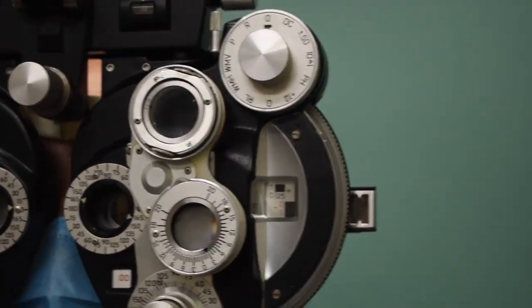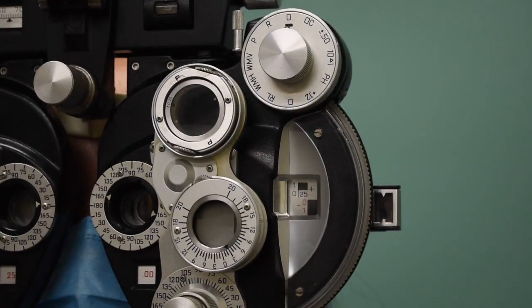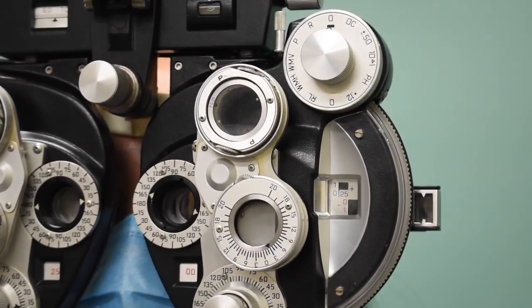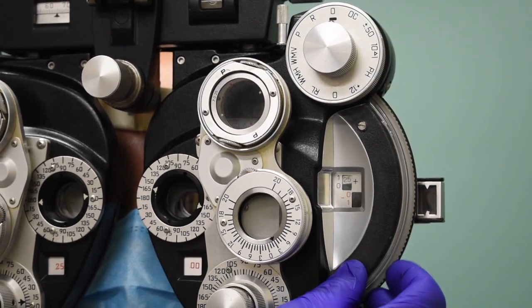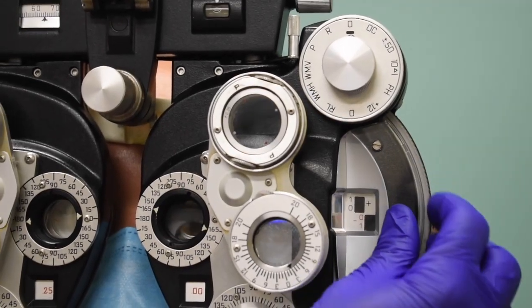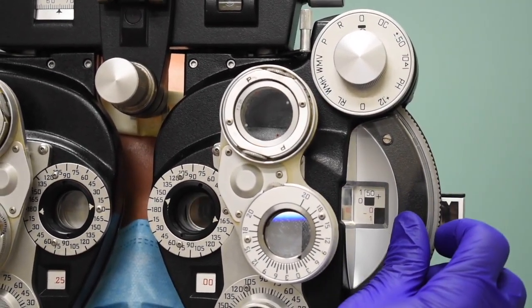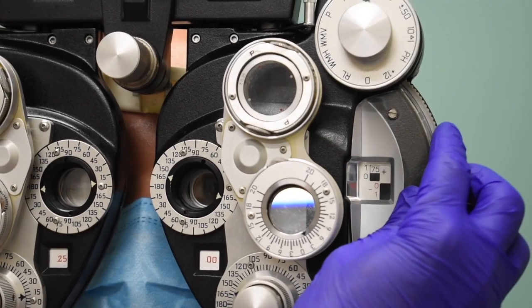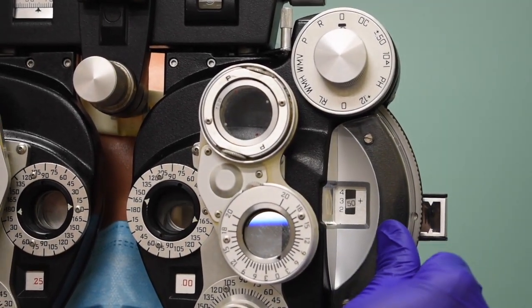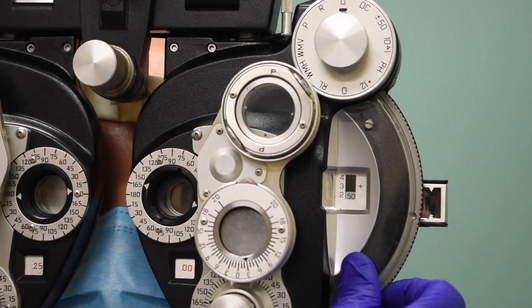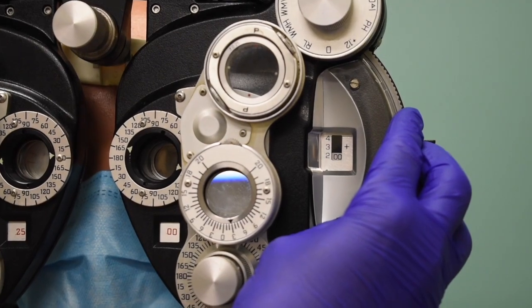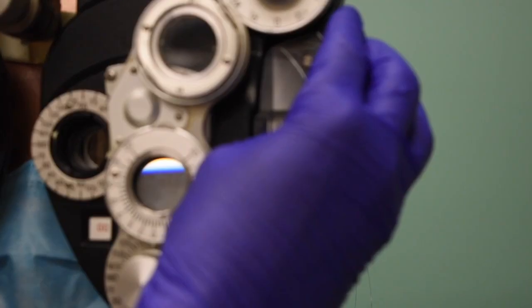And over here, same thing as before. You would not record that as plus two for the bichrome. That's our 2040 blur. I apologize. Tell me when those letters are so blurry you can't make any of them out. Right here. Okay. I'll go two past. Tell me when you can make out just a couple. Right here. Good.